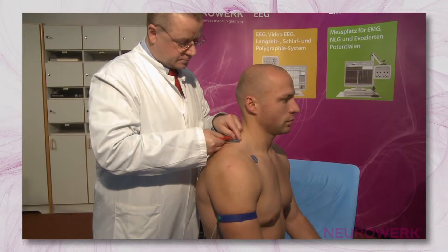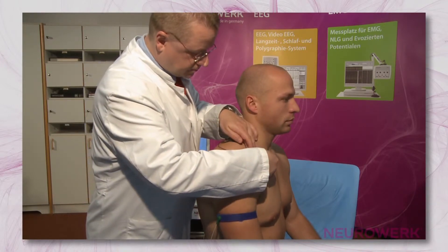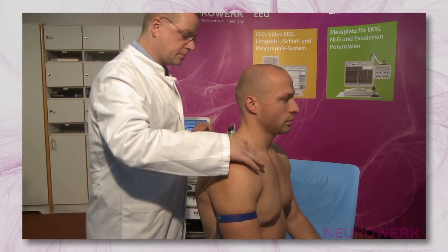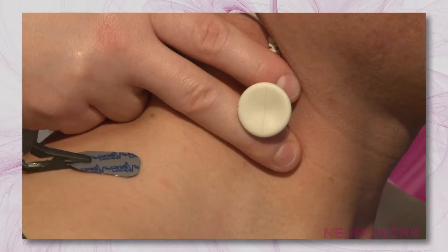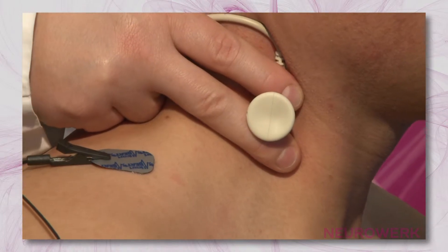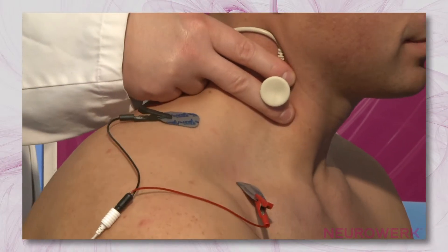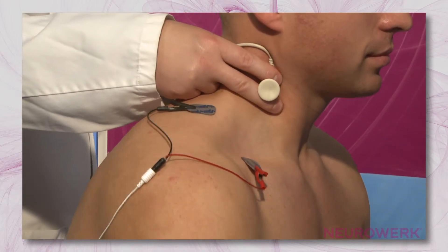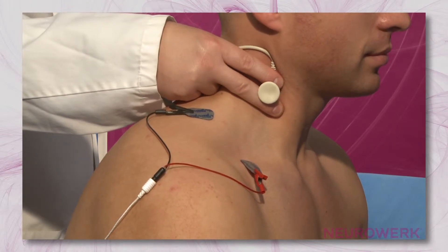The repetitive stimulation, which is also known as the myasthenia test, is a measurement for the diagnosis of myasthenia gravis. This is a neurological disease characterized by stress-related muscle weakness. The examination will be demonstrated on the accessory nerve; however, it is also possible to examine all other motor or mixed nerves.